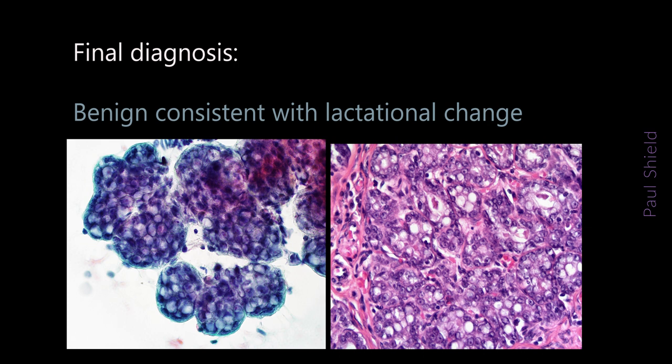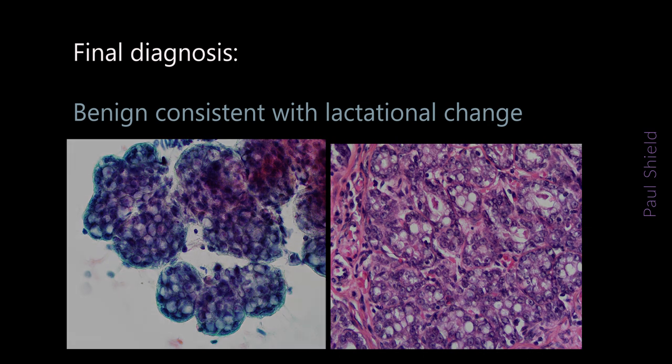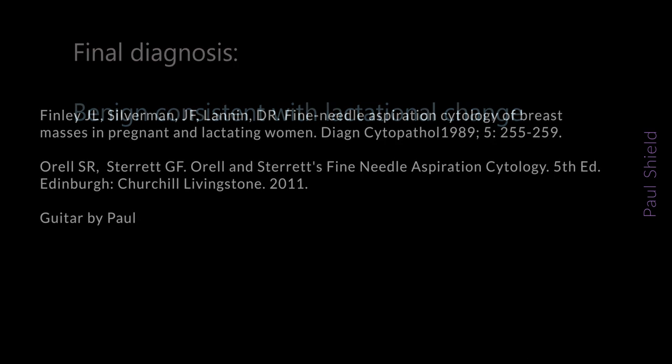And just finally, it's important really not to underestimate malignant cell changes in this setting, especially if there's any anisokaryosis present. Malignancies do occur in pregnancy, and false negatives can occur if the atypia present in a malignancy is just put down to a lactational gestational effect.